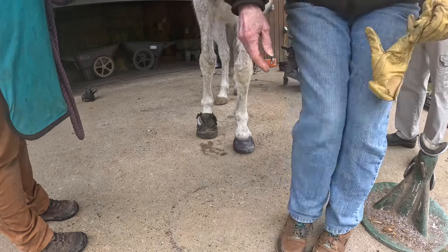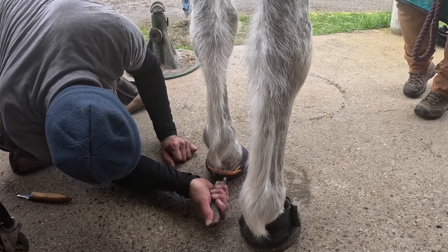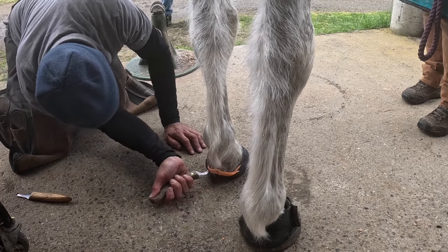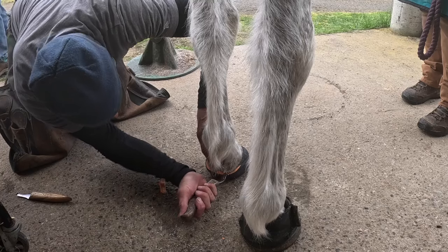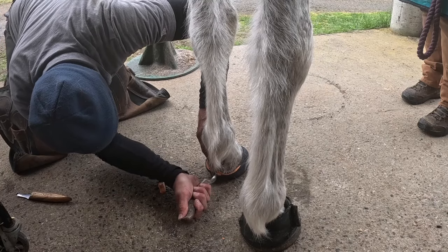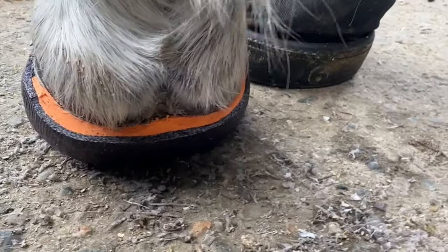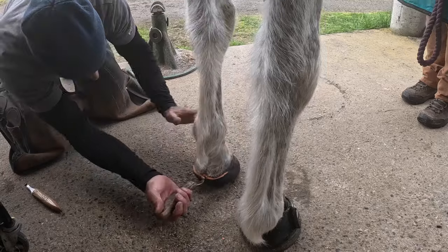So what's the closest you would want to be to that corner? This could be fine, but it's a little close. I'd like it down further. I like to keep the casting material at least a half inch below the bottom of the coronary band.